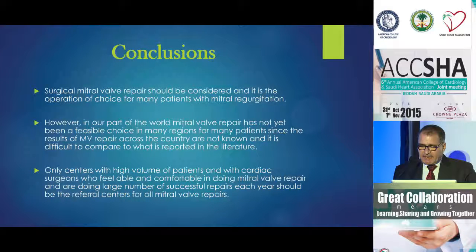All the centers with a high volume of patients, with cardiac surgeons who feel comfortable doing mitral valve repair, and with a decent echo department with excellent echocardiographers who can help identify the pathology and assess the result of repair, should be allowed to do these surgeries. Mitral valve repair is successful.